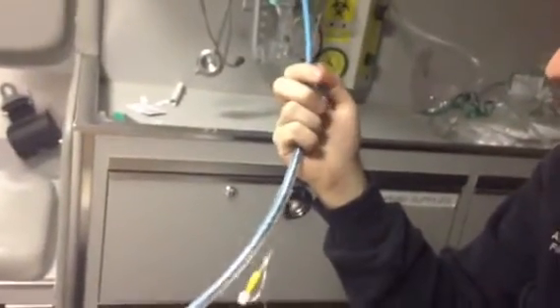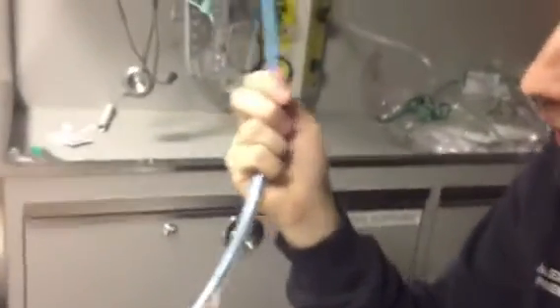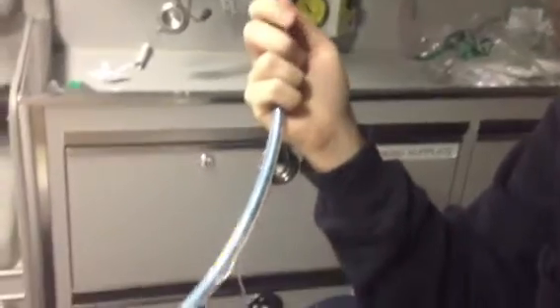The key to this is keeping your pointer finger and thumb on the bougie and the rest of your fingers on the tube. It takes a little getting used to, but once you do, it's a lot easier and saves you time.